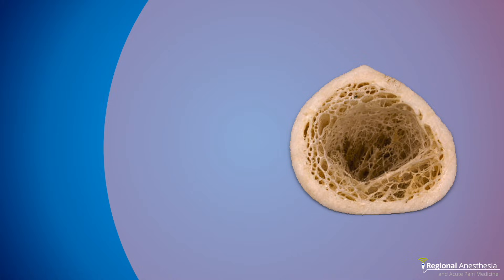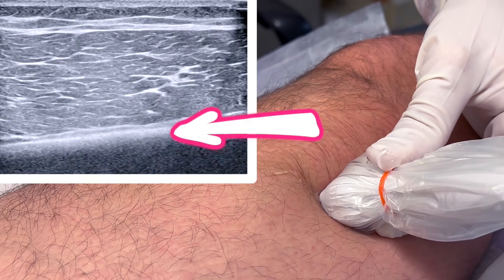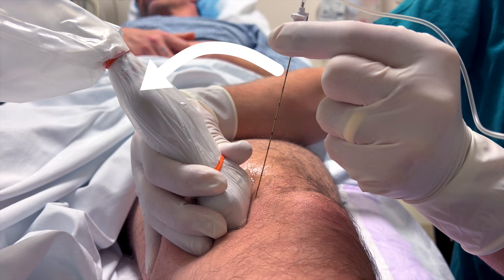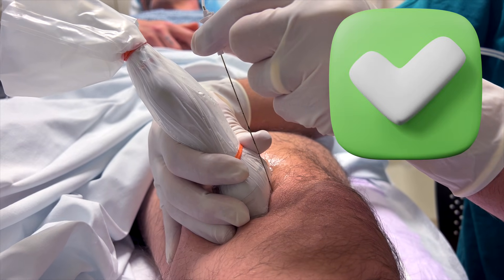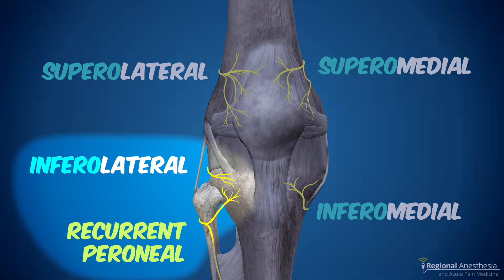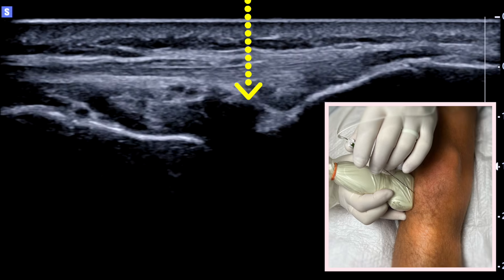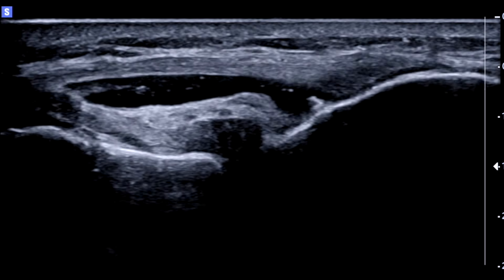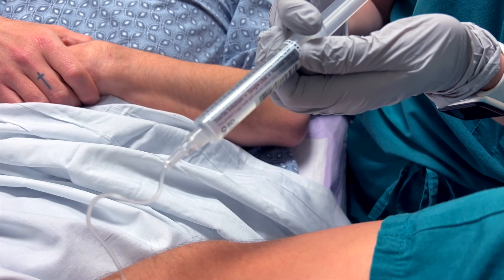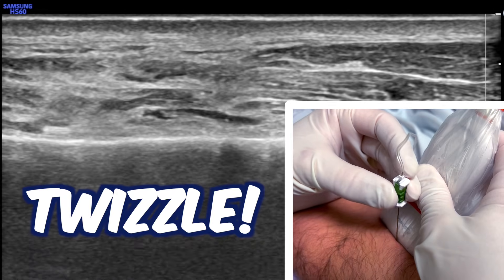Here are some things we learned along the way. Despite the femur being the biggest long bone, it's surprisingly easy to miss it. Toggle the probe back and forth until you see the bright white line that represents the beam hitting the cortex directly — the hazy structures on either side represent the beam catching the femur tangentially. Second, without an in-plane approach, keep your needle angle as close to the beam as possible; otherwise you may miss the femur entirely. There has been concern about targeting the inferolateral and recurrent peroneal nerves when using neuroablative techniques because of the proximity to the common peroneal nerve — nobody will thank you for causing a long-term foot drop. But using this technique with a small dose of local anesthetic and ultrasound guidance, we just don't see this, and for that reason we do perform the inferolateral blocks. Like a lot of bony contact blocks, the muscle can be adherent to the bone. We like to use saline to test if our needle tip is truly on the periosteum so we're not wasting local anesthetic. If we see intramuscular spread, it's useful to do a little twizzle with the needle to break through those last few layers of soft tissue.